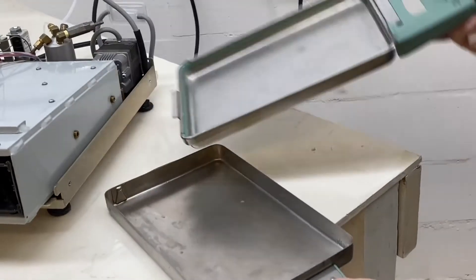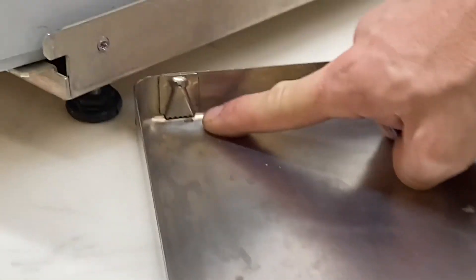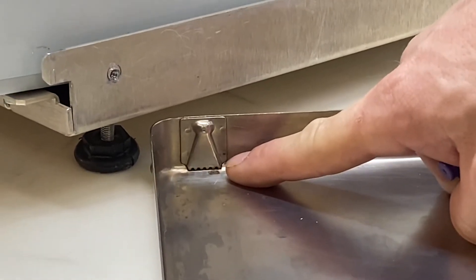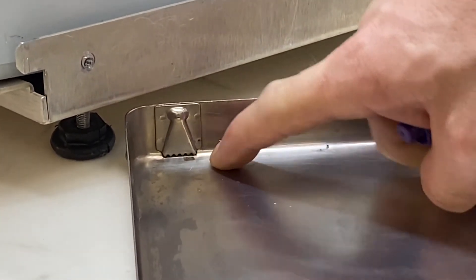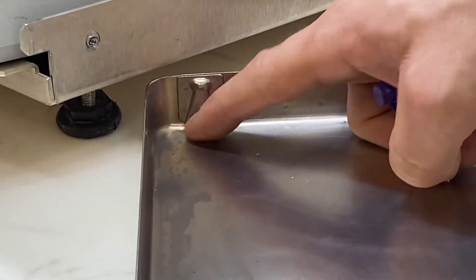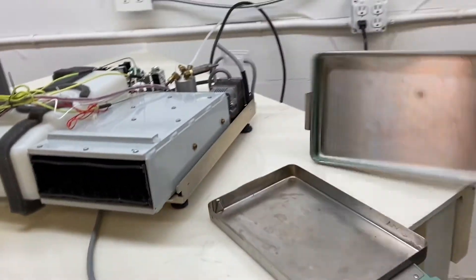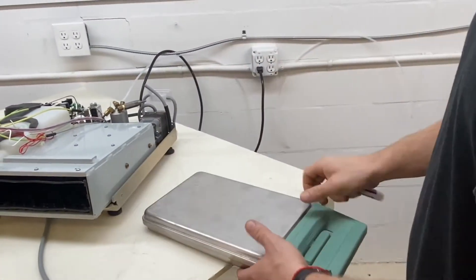First things first, we're going to take the cassette out and look at the venturi. The venturi is right here — that's where all the water gets sucked out at the end of the cycle. So if you have some plastic or paper or anything that gets melted right there, that would cause cycle fault number eight.